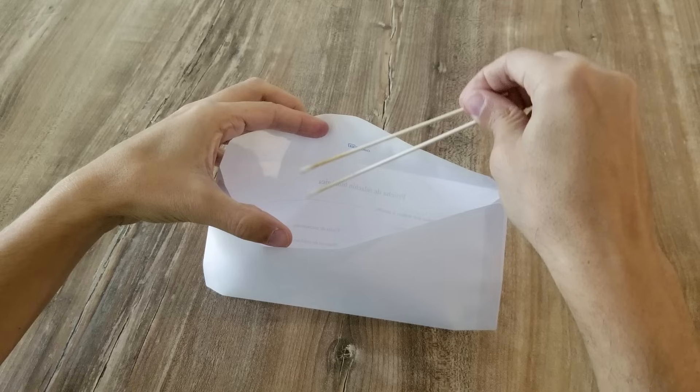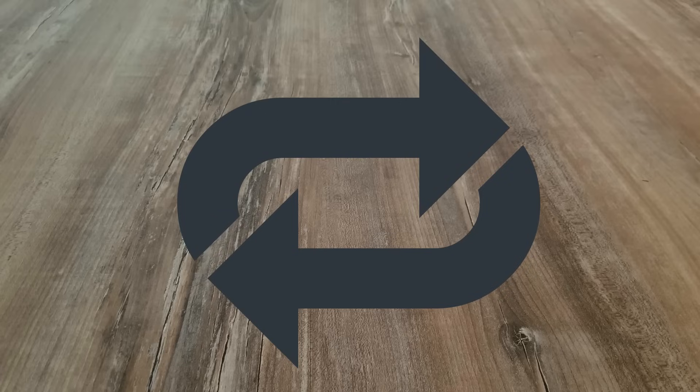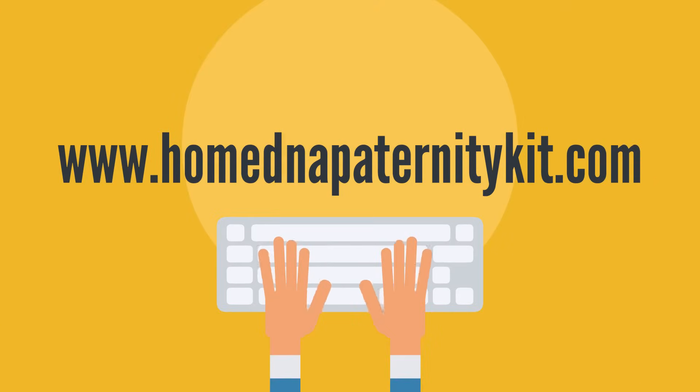Step number 6: Insert the swabs into the respective envelope. Repeat the entire process with the second participant and send the samples to our laboratory. If you have any questions, do not hesitate to contact us. We offer services in English, Spanish, and French.